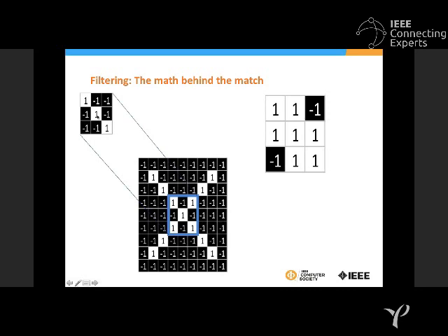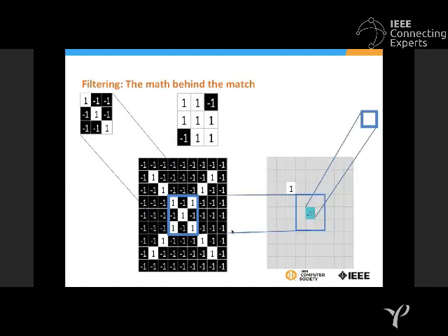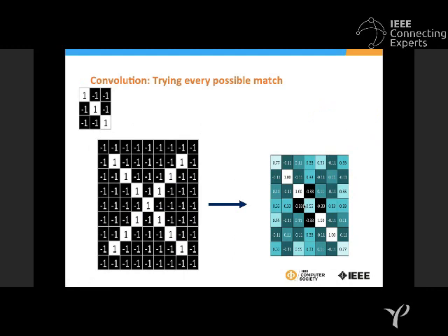So this particular filter will not give very strong values corresponding to this region, because this filter is not so well mapped with this particular feature, right? And so you see that the feature value decreases to 0.55 compared to the one which was a good feature value. So what I do, I convolve this filter matrix over the entire image in patch form, and we generate the convolution output for this image corresponding to this particular filter.